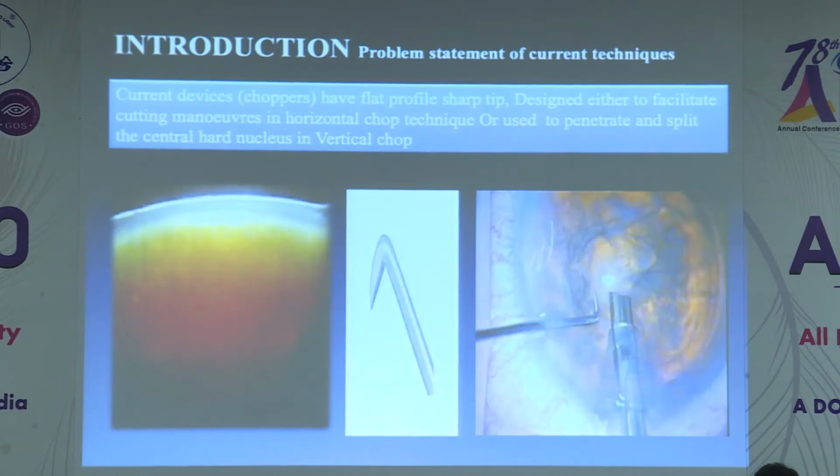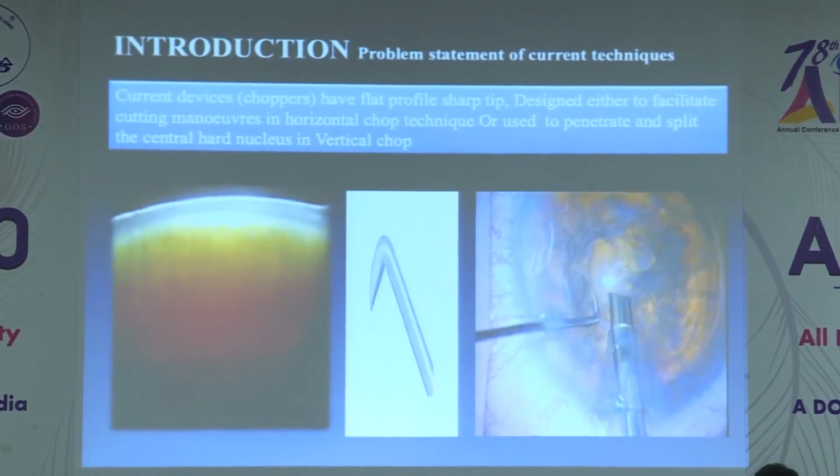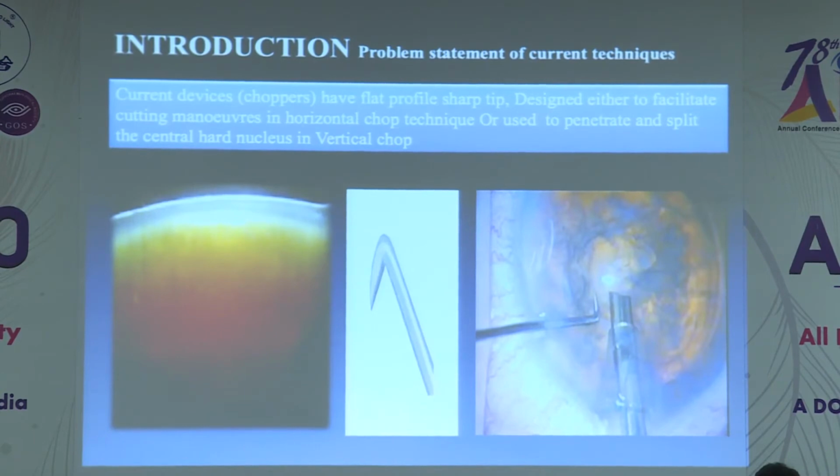But the devices we use normally now in our phaco-cataract surgery, the choppers, the existing choppers, have a flat profile. Flat profile means it's thin and flat, and that is what we use, because they are basically meant to cut the nucleus. So in horizontal chop, we are trying to cut the nucleus from the equator, from the periphery towards the center. We cut the nucleus and then we tend to split the nucleus at the center. So we try to cut. That is why these choppers are designed like a sharp knife, a cutter. And what happens if you have a hard nucleus of this kind, you are not able to cut it properly. So cutting the nucleus is more difficult than cracking the nucleus.